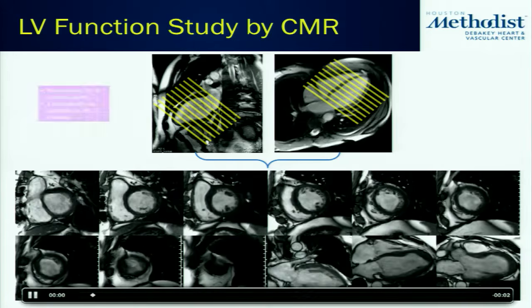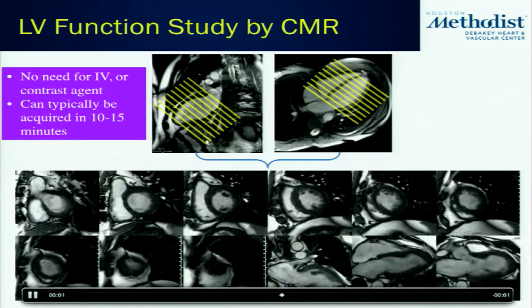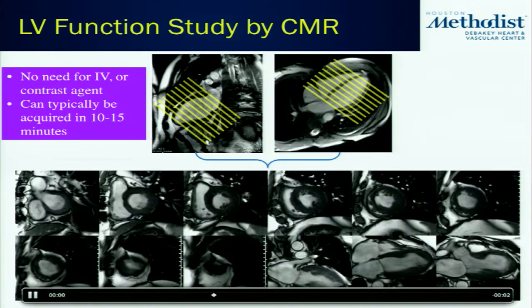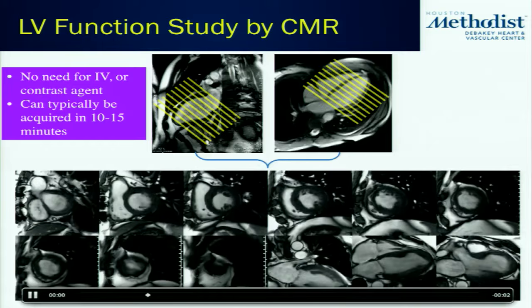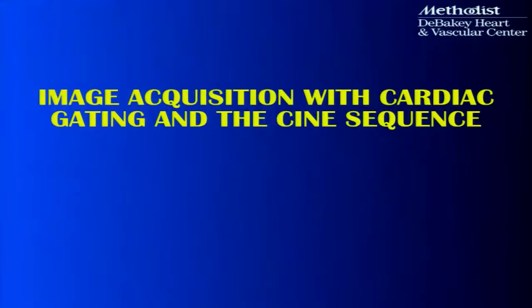Let's skip forward here. The key things with this, if you just want LV function assessment, doesn't require an IV, doesn't require the need for contrast, and this study can really probably be performed in about 10 minutes. So it's actually a fairly fast assessment for LV function and volumes.